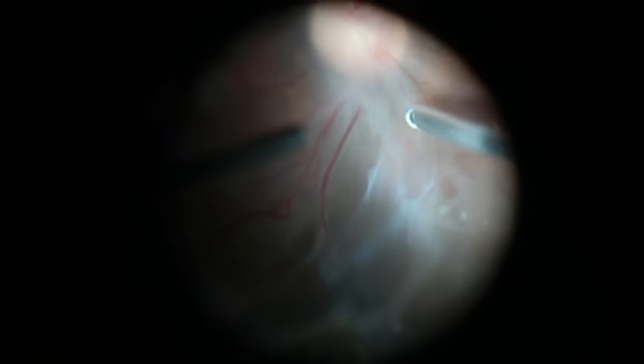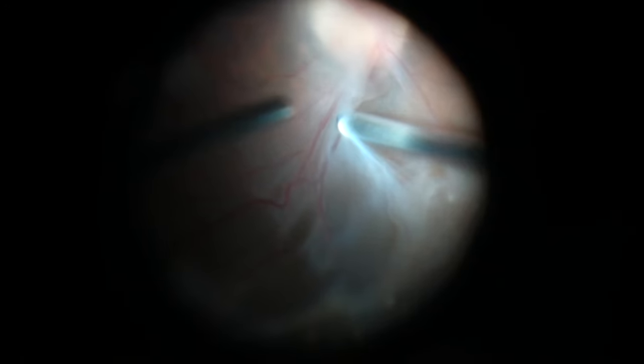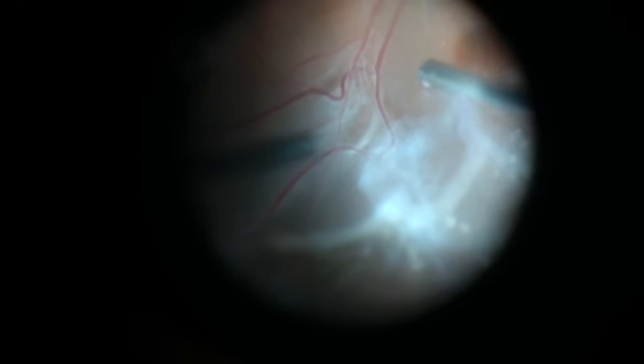I was able to release the traction from this area using the scissors, and then the areas around the nerve often can be dissected using the vitrectomy cutter both to gently pull on the retina and also to trim any areas of adhesion.